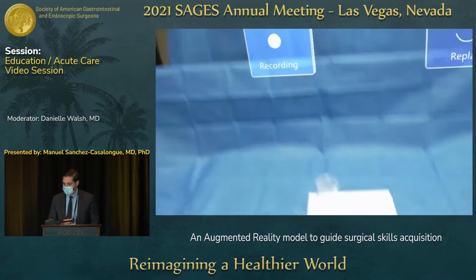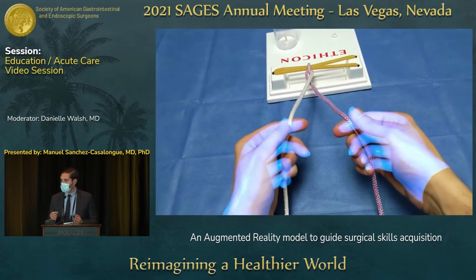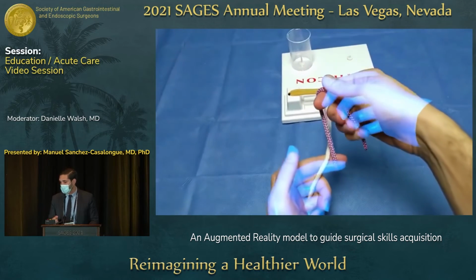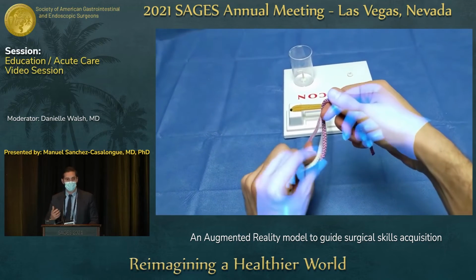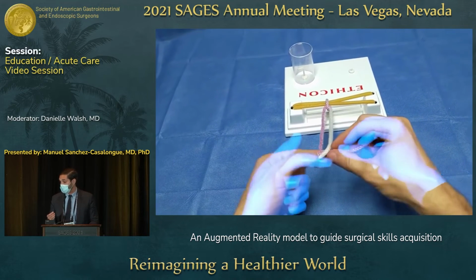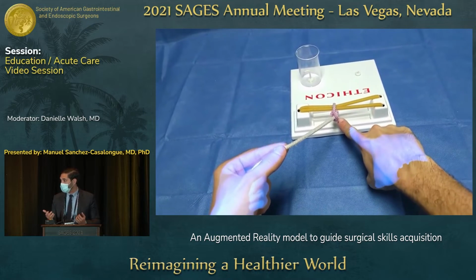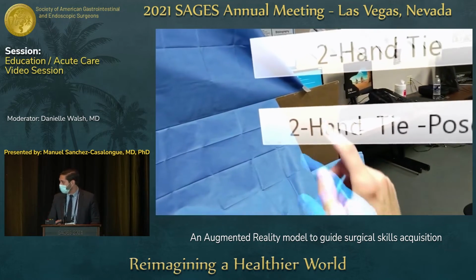Another feature we have is that we can actually record specific moments that the teacher thinks are important for teaching this skill. So for example, here there's a flash of yellow. Every time we say mark, or the teacher is recording specific mark spots, these will be accessible later, so the student can replicate them. And what this really gives is a really broad platform, so anyone can record these, and so there's not just the way I tie knots, anyone can decide.